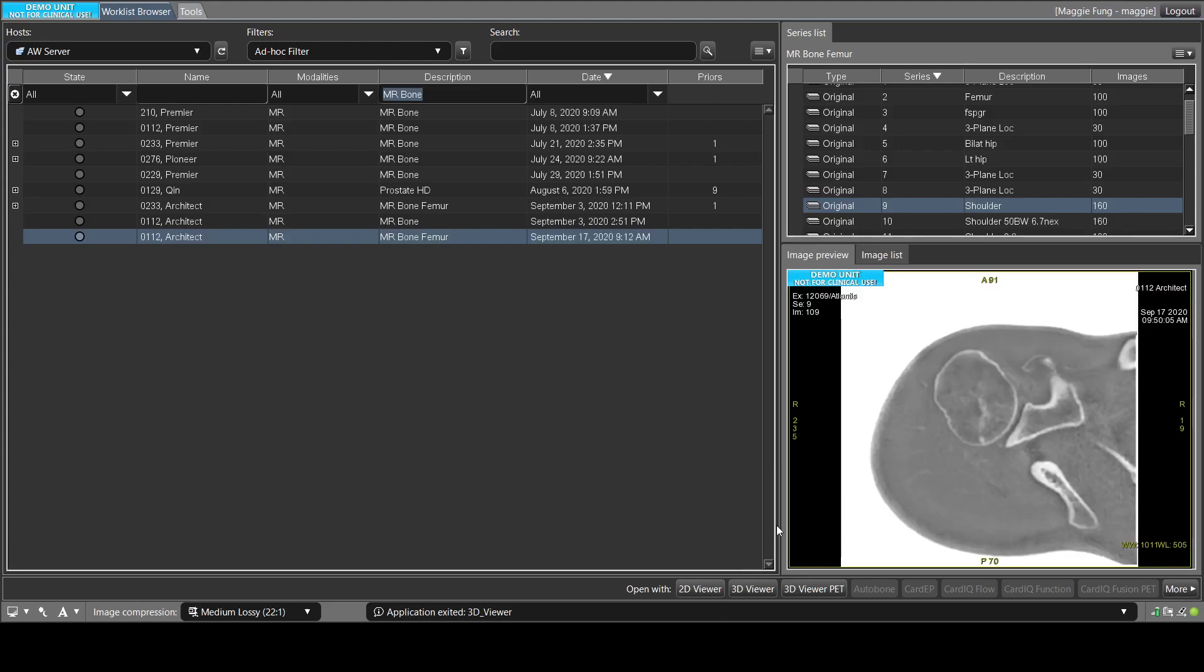Hi, today I would like to show you how to do volume rendering on an osteo ZTE bone sequence. First of all, you select your series, and then you open the 3D Viewer.